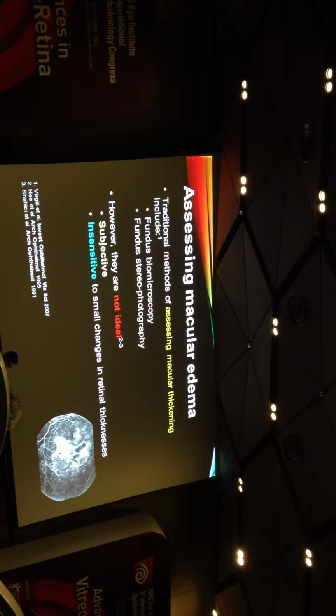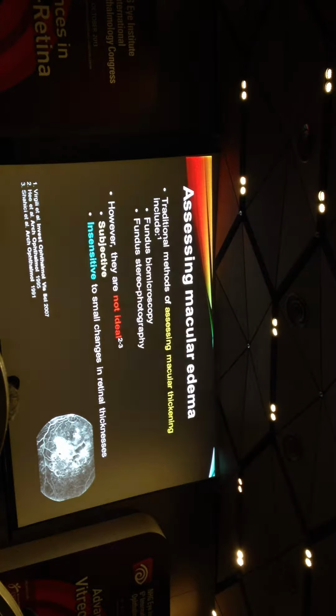Frankly, I try to test myself in clinics. I'll actually examine the patient before I look at the OCT so as not to be influenced by it. And sometimes I'm happy in the sense that I pick up the areas of thickening and edema, but at other times I realize I'm just completely wrong. I think it's edematous and it's not, or vice versa. Maybe I shouldn't have said that since my boss is in the audience, but never mind.